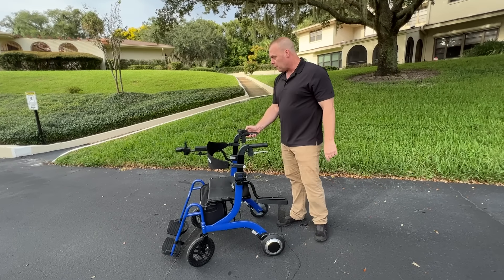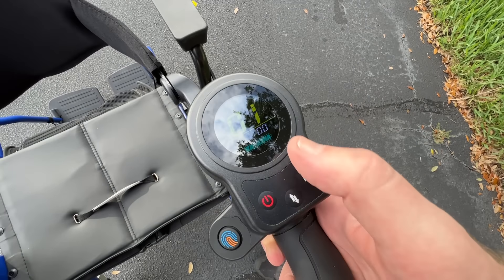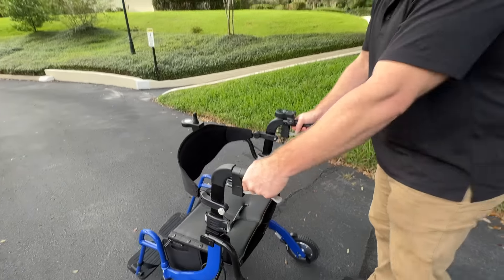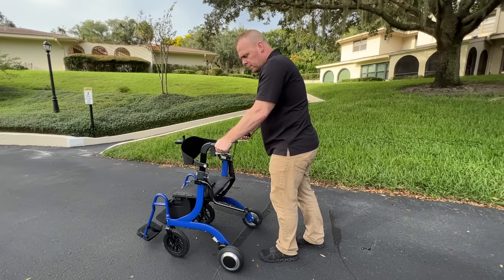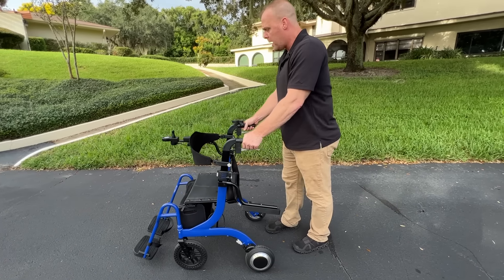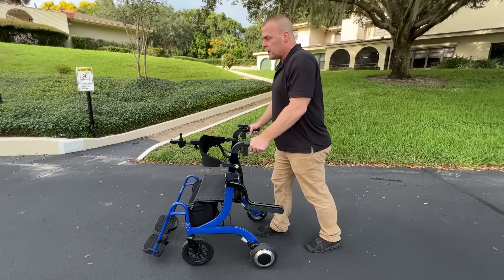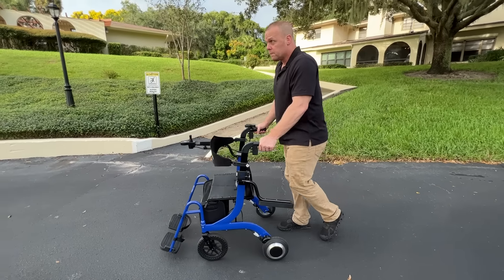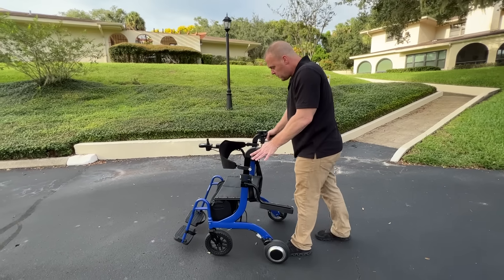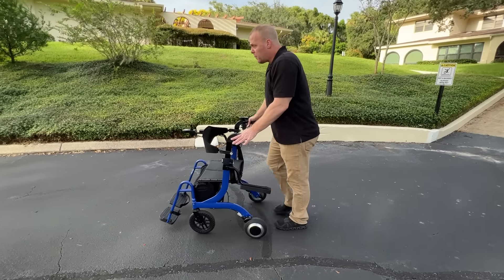So here's what I'm going to do — I'm going to press the power. I'm not going to put it in C, I'm going to put it in manual. I kind of want to go slow. You know what this does? This actually puts some resistance into the wheels. This is about as fast as I'm able to walk right now. I'm going to go a little bit faster — I'm going to press M and go to the two setting. Maybe I'm feeling really good right now and I'm going to go for the three. So right now, this has resistance in the wheels and this is not allowing it to roll and just get away from me entirely, which is really nice.